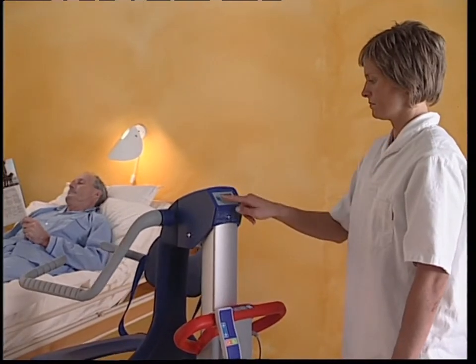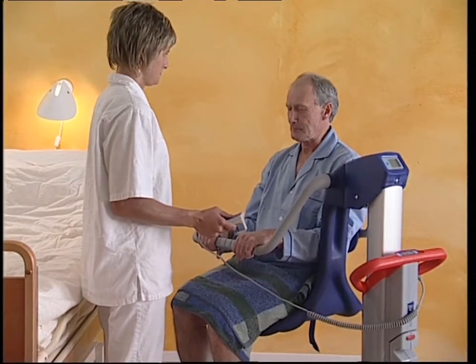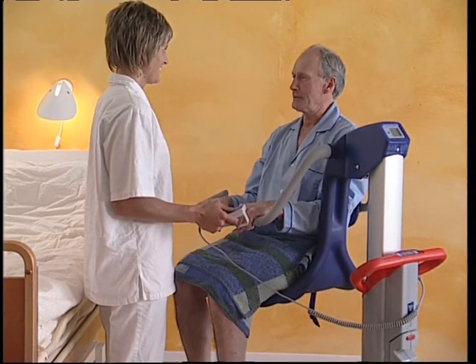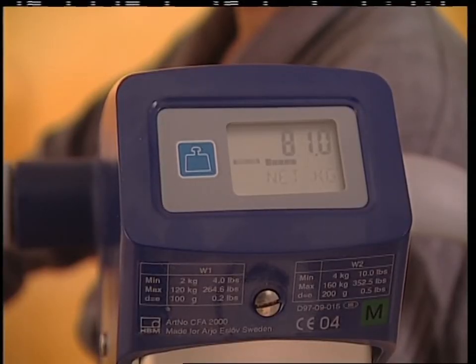Push the button again to get the net mode. Seat the resident on the Alenti. Raise the lift so both the chair and the resident are clear of the floor or bed. The weight of the resident will be shown on the display.